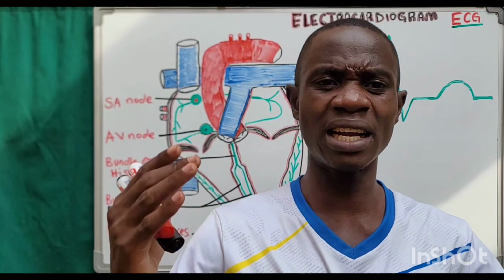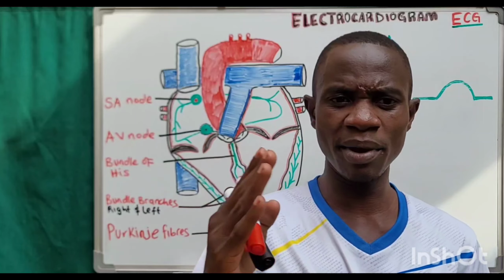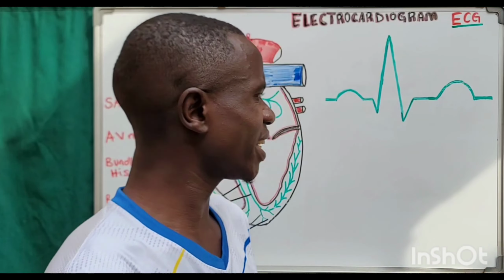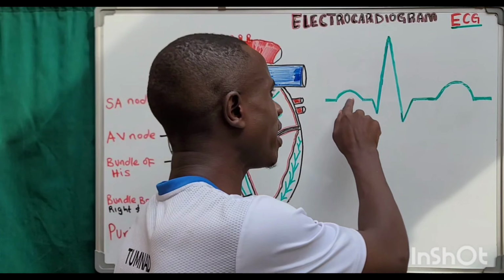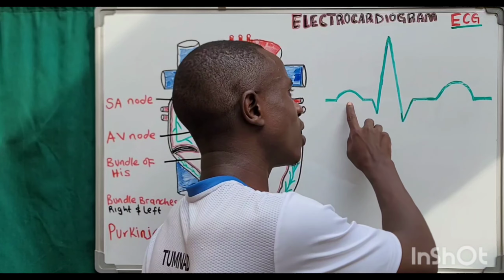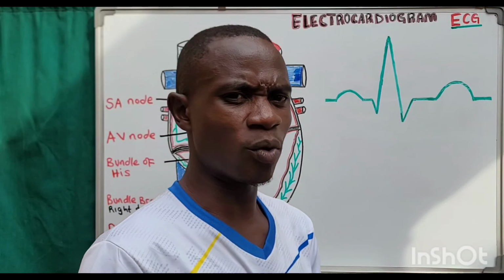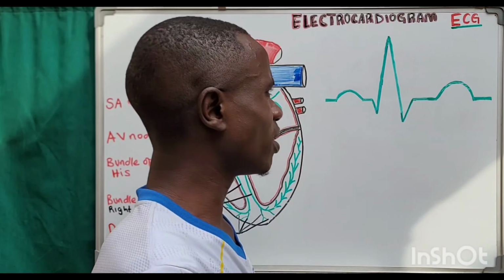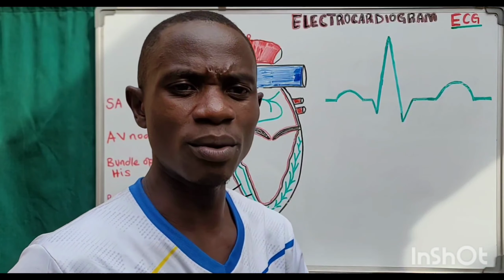The ECG tells us a lot in the deflections, because as the ECG machine measures the electrical activities, it gives us a wave pattern. These are the waves which show a normal ECG, and if anything differs from this kind of arrangement, it tells us that there is a problem going on with your heart. So now these are the normal deflections of a normal ECG.